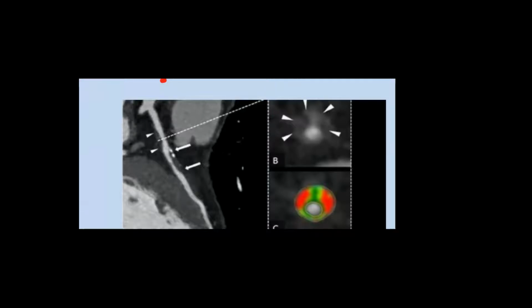It's not an OCT, it is a CT. It detects just the wall. I know. But we take the lumen from the atheromatous side until the healthy part, as you drew here, your line before.